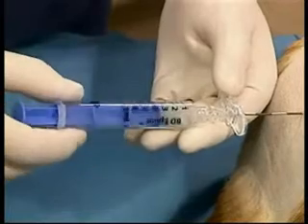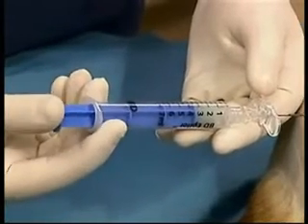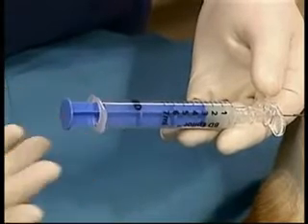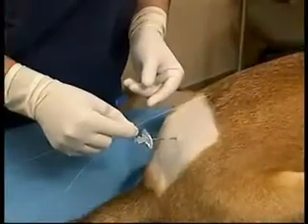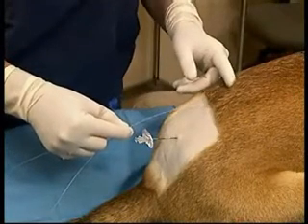This syringe is attached to the needle and approximately 1 cc of air is injected into the needle. If there is any resistance on the plunger of the syringe, the needle is in an inappropriate location and should be reinserted. Once the position of the needle has been confirmed, the catheter is inserted. The catheter should be pre-measured to the approximate desired location.